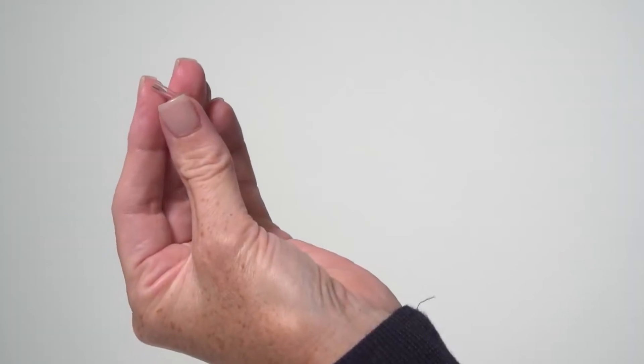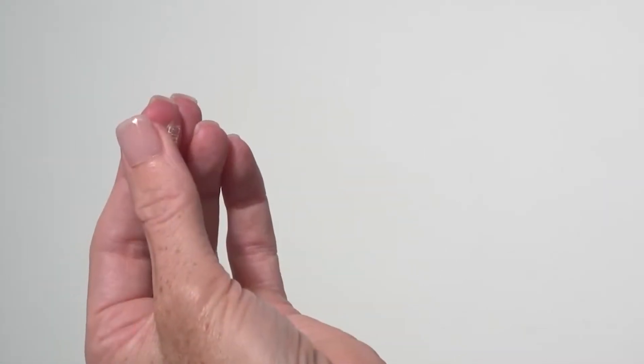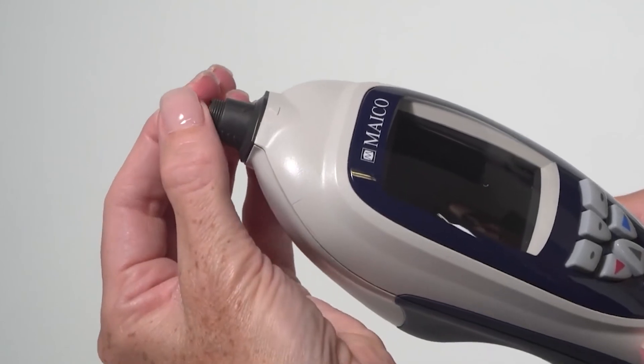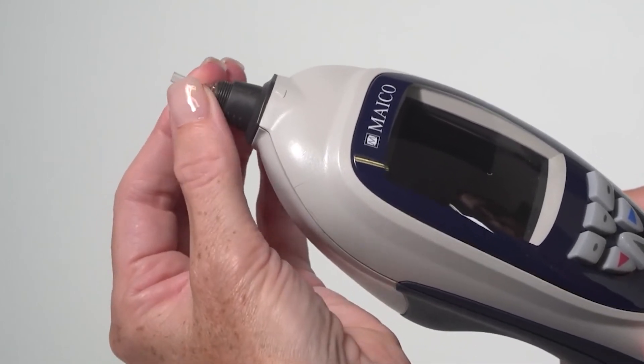Once visual inspection shows the probe tube is clean, place the probe tube back on the probe. Make sure to align it appropriately on the probe as it can only be seated in one direction.